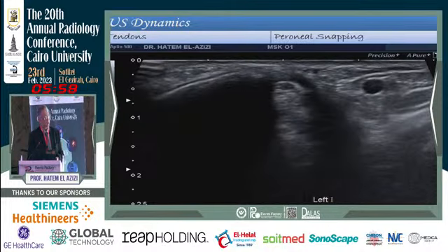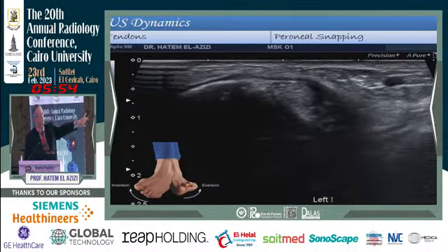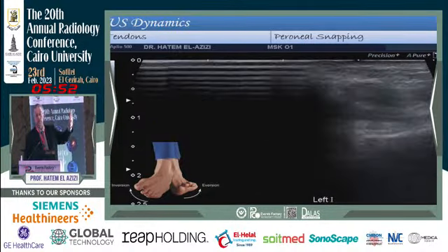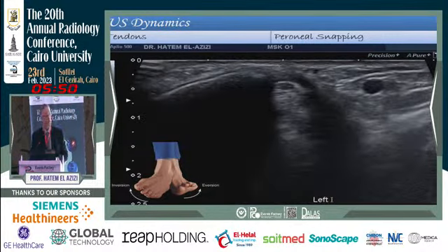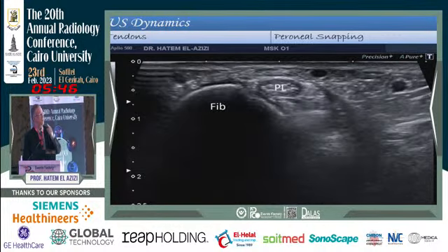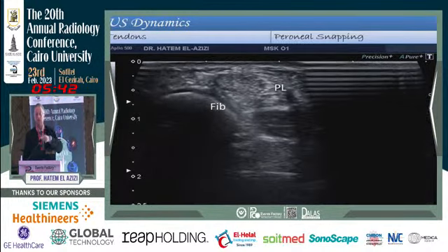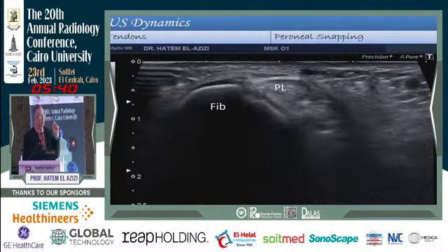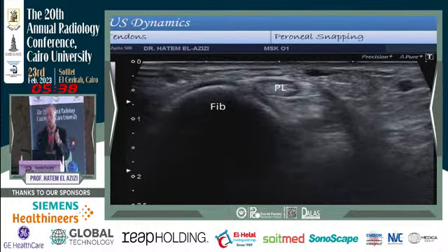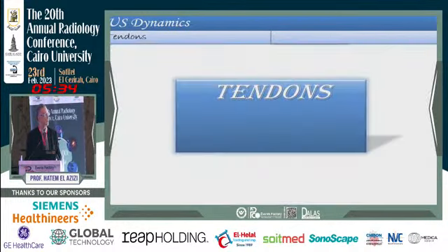we're making the eversion and the inversion of the foot of the patient. Both tendons are in place, no movement of the tendon. But in cases of snapping, this is the peroneus longus and peroneus brevis sliding around the tendon, causing the snapping, and again, we will never detect it either in MR or in static ultrasound. We can detect it only on dynamic ultrasound.